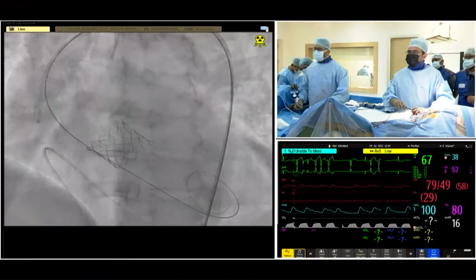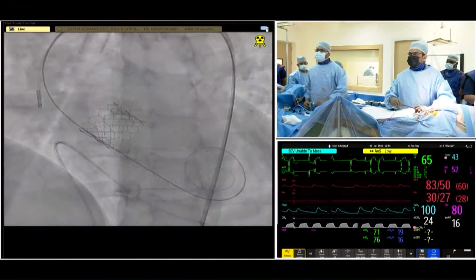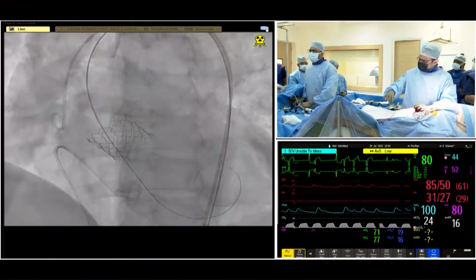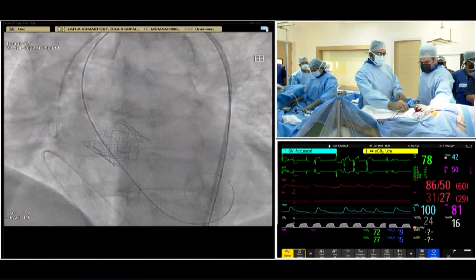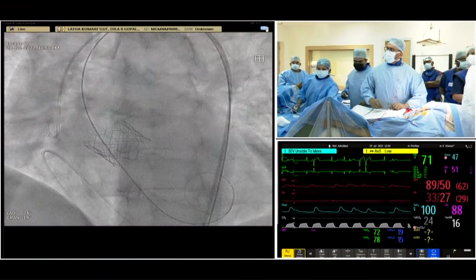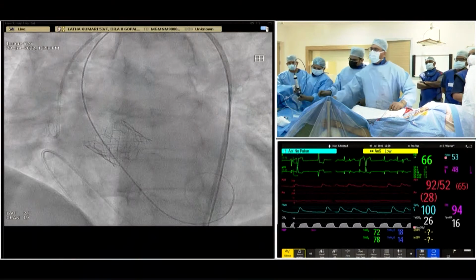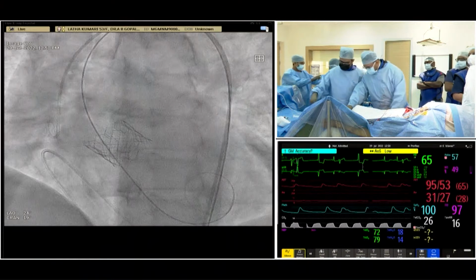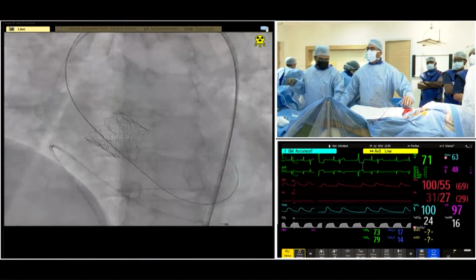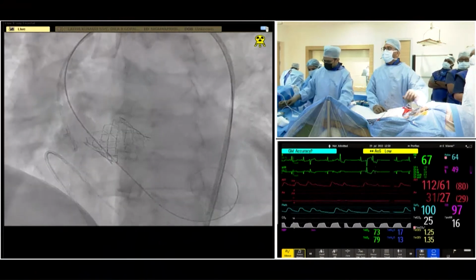So this patient, I was very worried about the conduction abnormality that one could get because she's had 2 syncope. Anybody who has syncope, I'm very worried that it may just be a conduction abnormality, because I still struggle to believe that it's all due to aortic stenosis. However, she had absolutely no conduction abnormality on baseline ECG, and her membranous septum was only 3 millimeters. So I was very, very cautious to make sure we have a very high implant and not leave her with a pacemaker, because young TAVRs with pacemaker, not a good idea.